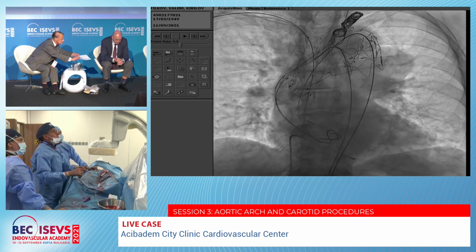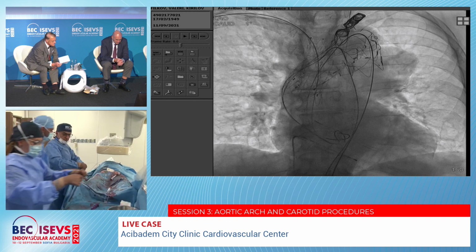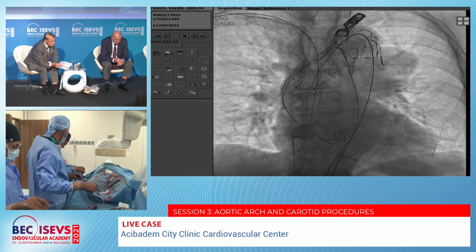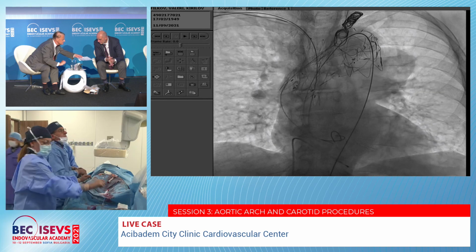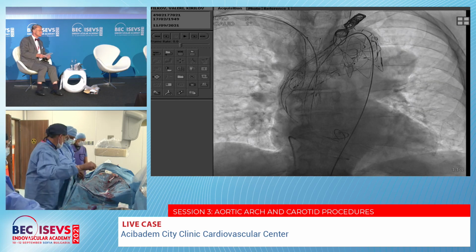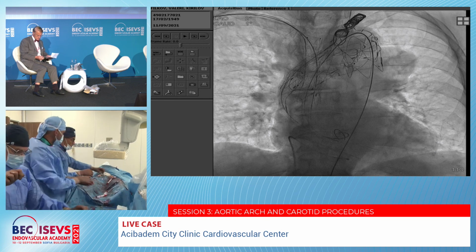The aortic graft is with very good apposition. I had some resistance during removing the pigtail. It means it's over the landing zone in a perfect way. And we are ready for Manta. Okay, let's start with the large bore.